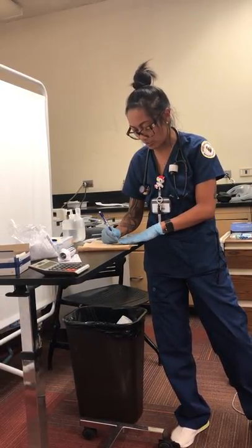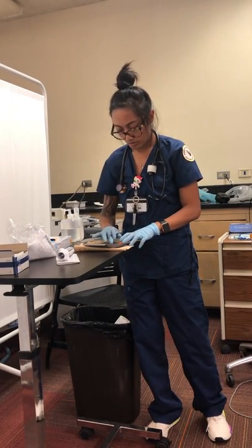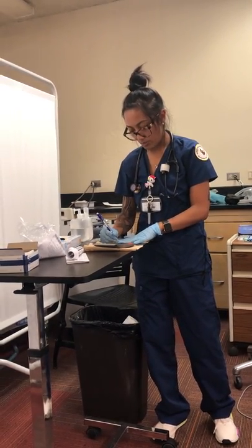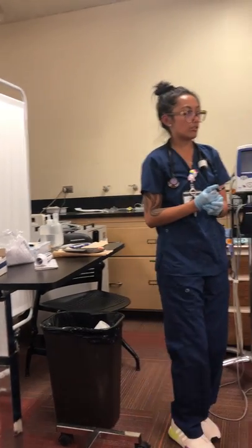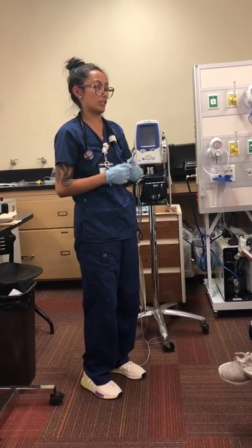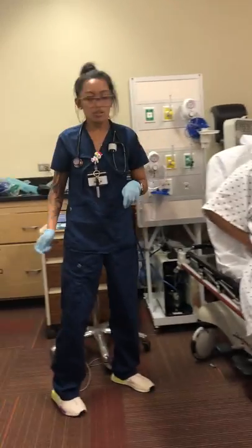I'm going to use 215 and divide that by 390, then multiply by 100. Your lungs are working at 55%, so they're not doing their best right now — that is in the red zone. It would benefit from the Duoneb, which has albuterol, to help make the air move easier in your lungs. I'm going to have you go ahead and sit back in the bed in a semi-Fowler's position, with your head at least 30 degrees up.